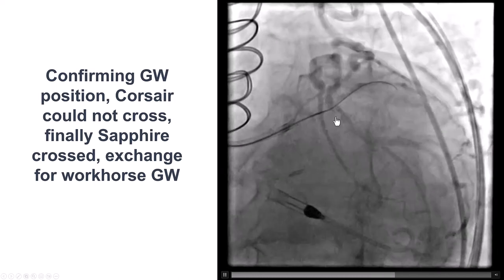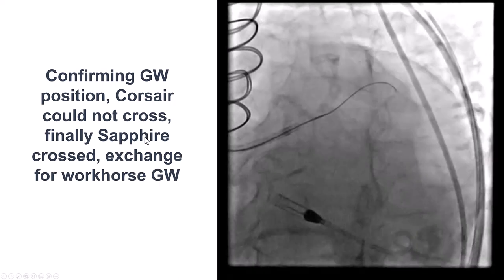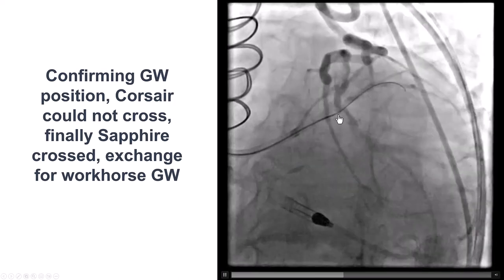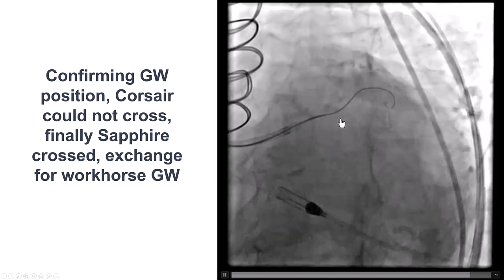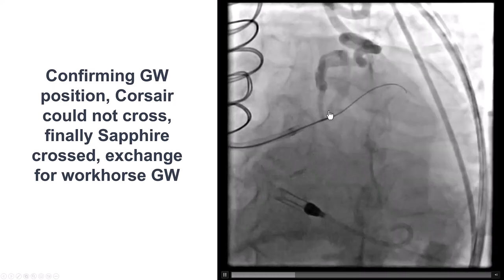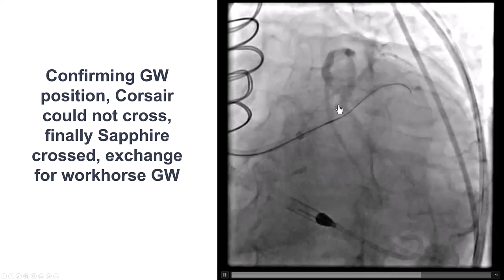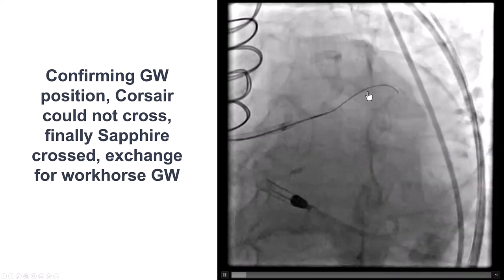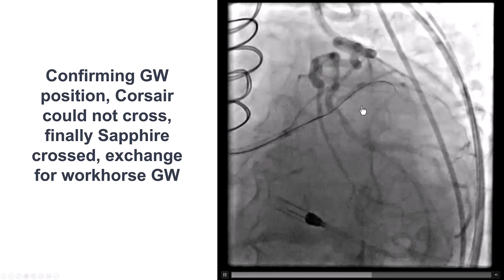The lesion was balloon uncrossable. The microcatheter was removed and a Sapphire Pro 1.0 mm balloon was used — the first-line approach for balloon uncrossable lesions. This successfully created a track through which the Gaia Nex 2 was exchanged for a workhorse guidewire.